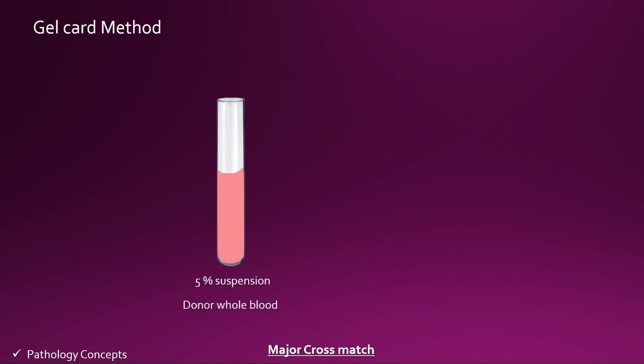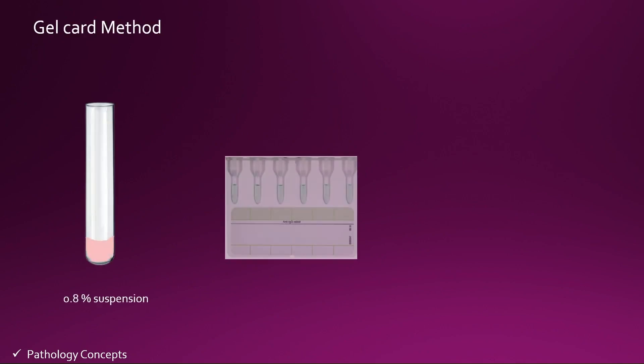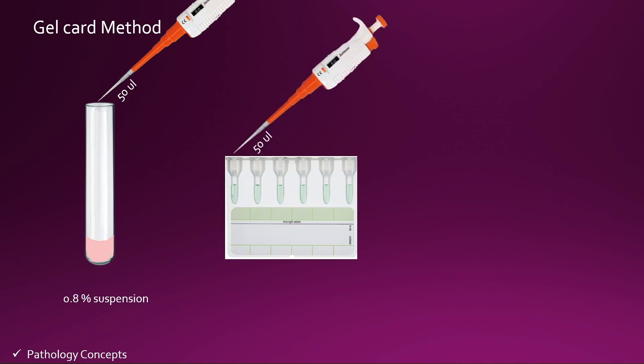Now let's learn the gel card method. First, take the 5% suspension of donor whole blood and take 1 mL of LISS in another test tube. Add 10 microliters of 5% suspension from the donor whole blood to the LISS test tube and make a 0.8% suspension. From this 0.8% suspension, add 50 microliters of RBCs into the gel card column.